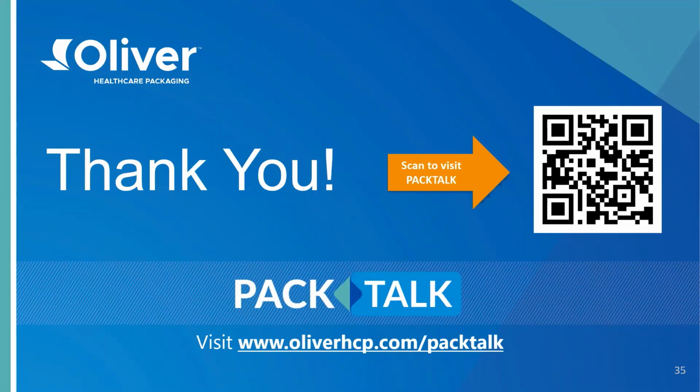And I would add to that, there are a lot of factors for your application, what's important and what's not, as far as aseptic presentation in your specific device, how it fits in the package, how it opens, and how it influences the opening features, etc. So you can do product family categories within your organization to limit the amount of usability studies that you do. But to extrapolate from another application may be a little more challenging, especially if you have to defend it.